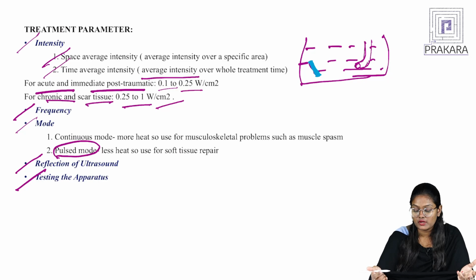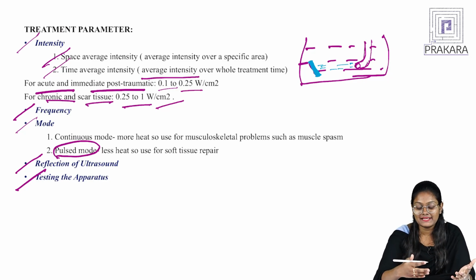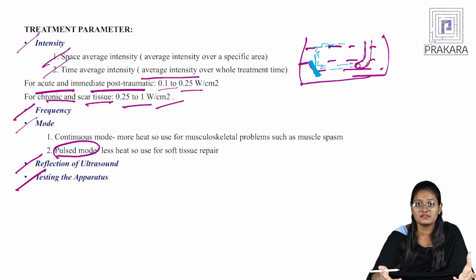When you turn on the machine, the ultrasonic waves will travel from the head, fall on this metal plate, and reflect upwards. They'll cause disturbances in the water. This is a sign that the ultrasound machine is actually working. Okay, this is one method.